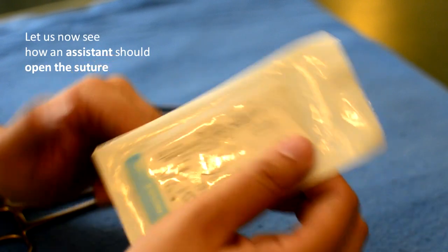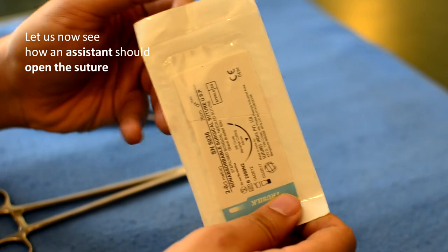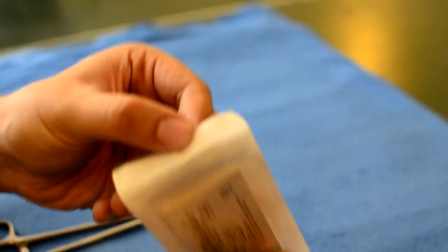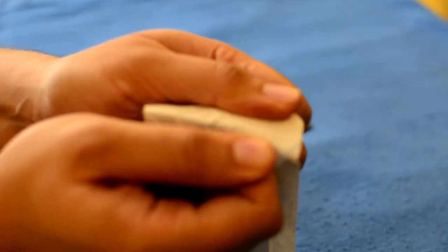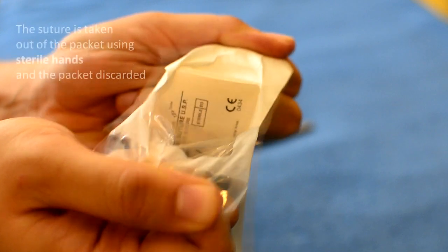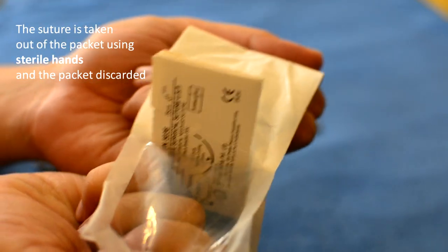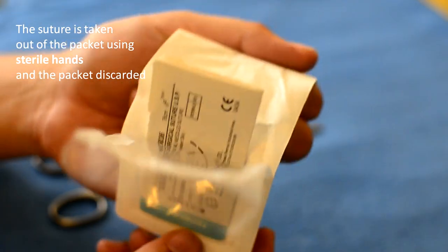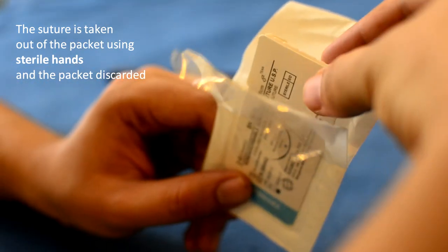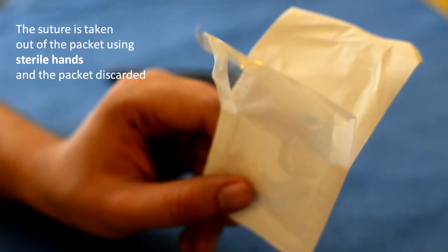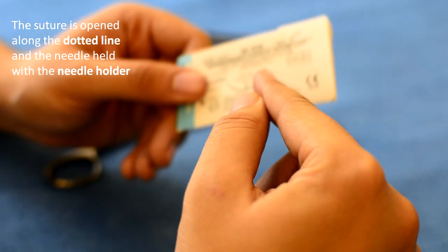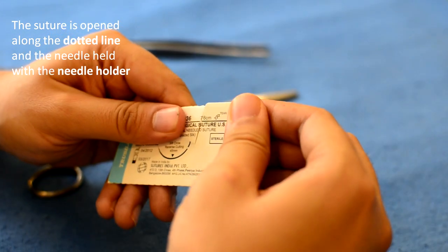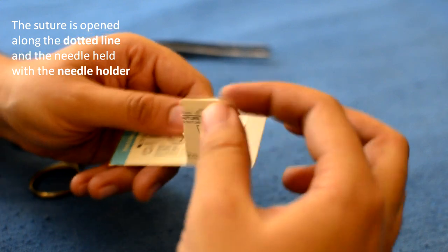Let us now see how the assistant should open the suture. The suture is taken out of the packet using sterile hands and the packet is discarded. You have to open the suture along the dotted line and the needle is held with the needle holder.